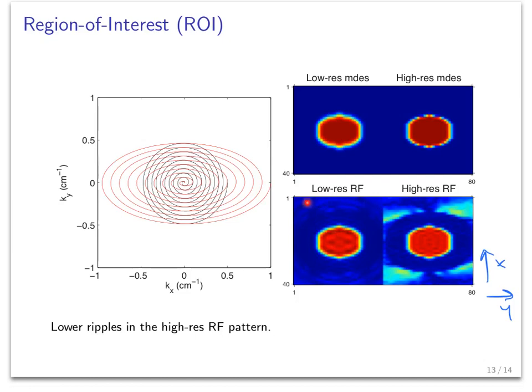But you can see that we don't have much excitation anywhere outside of the targeted oval, right? So this is a full field of view pulse, so it doesn't target much. It's higher excitation than we had before because we included the ROI, but it's still not a lot, especially compared to the high-res RF, which excites a lot of junk outside the ROI, right?